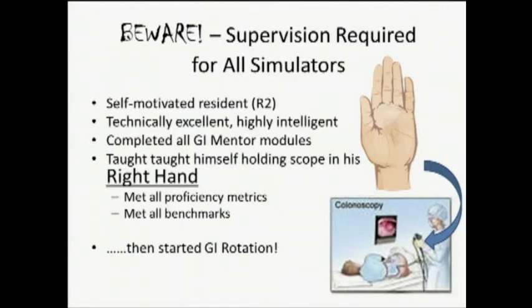This is a technically excellent, very highly intelligent, very highly capable resident. And he, on his own, went and completed all of the GI Mentor modules. However, he taught himself using the wrong hand, holding the scope in his right hand versus his left.